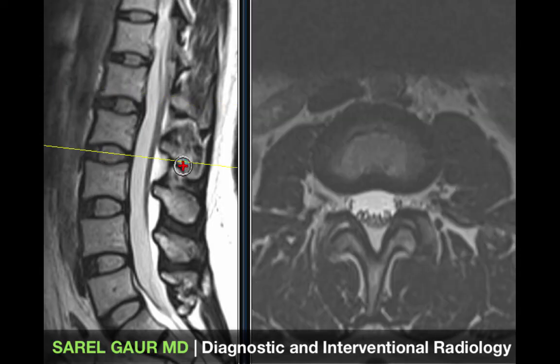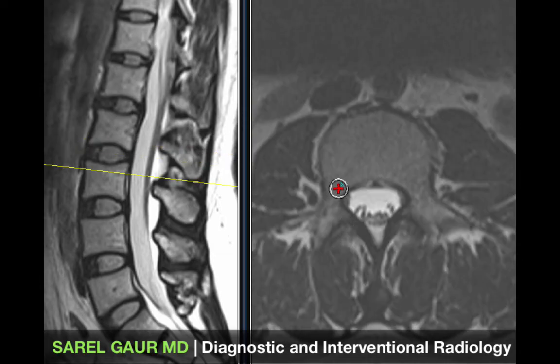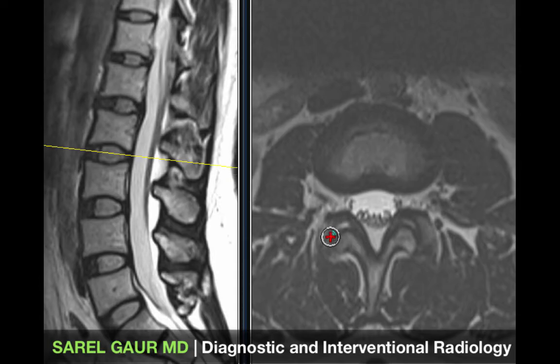Back at the intervertebral disc level, looking at the posterior elements: you can see the pedicle, the facet joint on either side, and how the bone connects posteriorly through the lamina to form the spinous process.